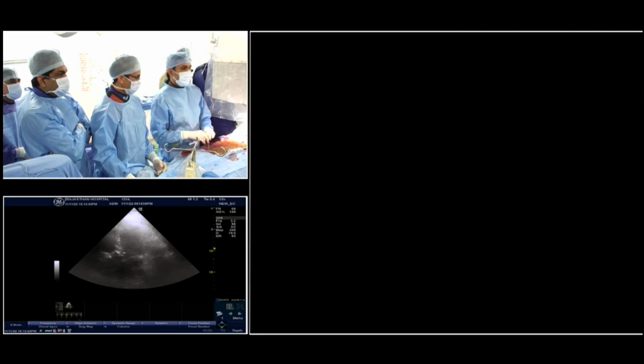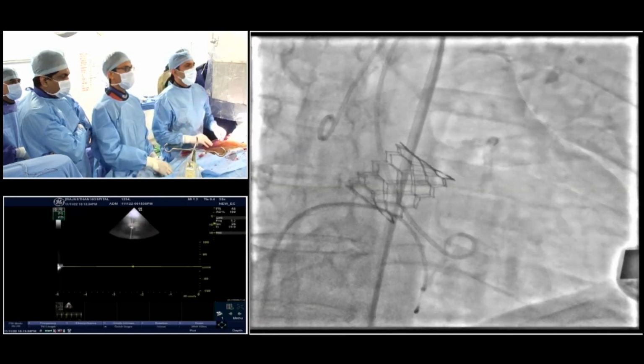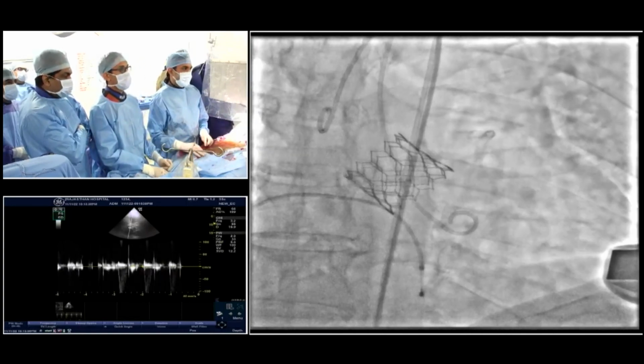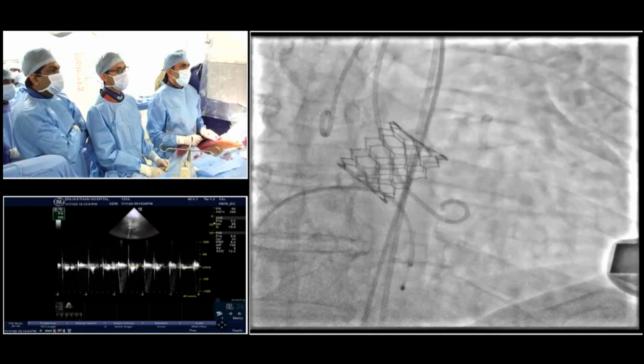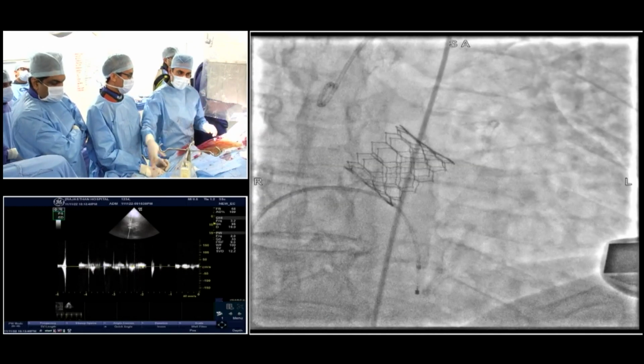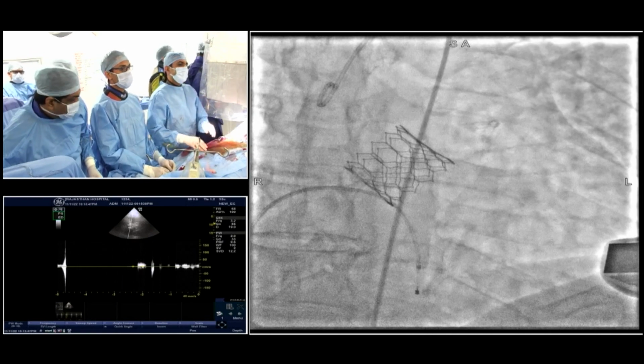Regarding stroke and dilatation, most of the studies suggest that stroke happens during post-dilatation and not during pre-dilatation. So basically, less instrumentation.